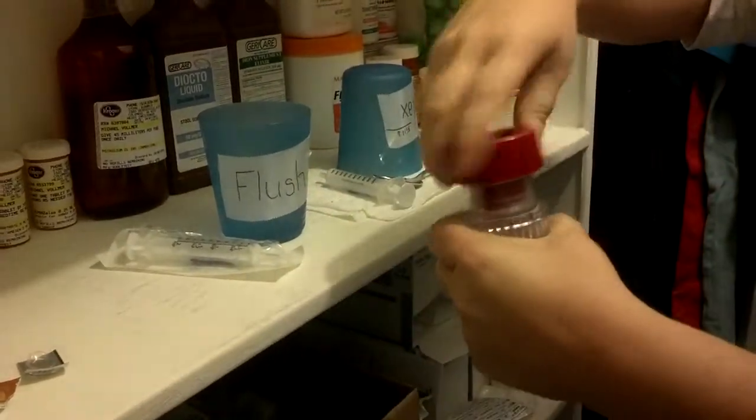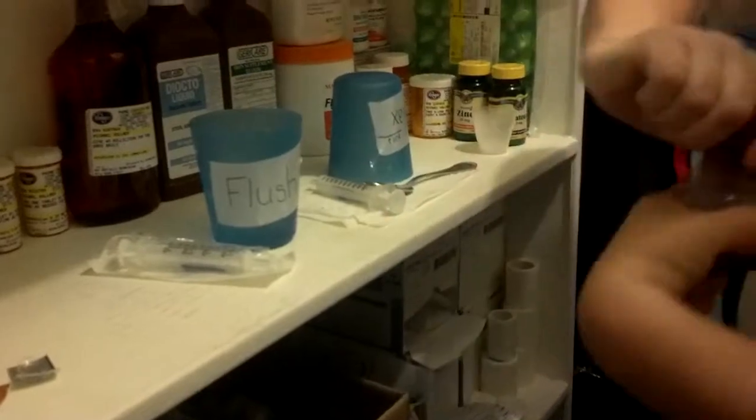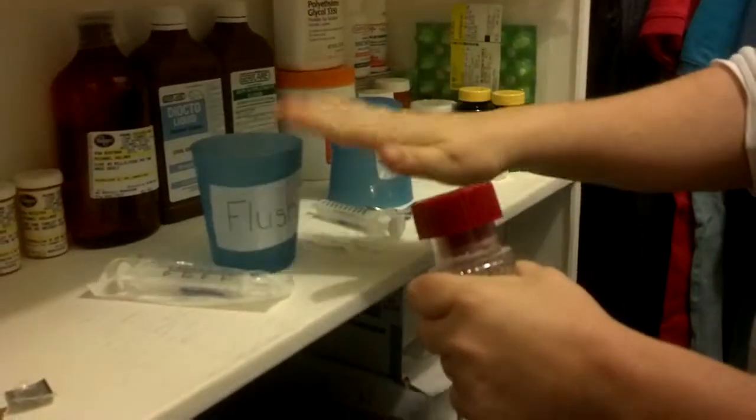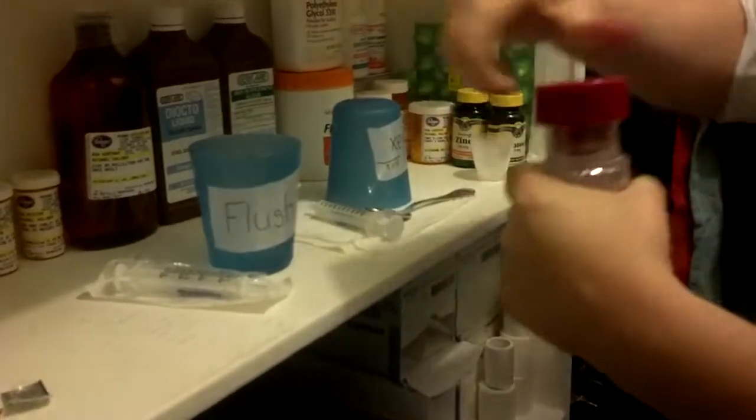Each morning you're going to get a new syringe and start everything with fresh supplies — fresh flush water, fresh syringe, all that kind of stuff.